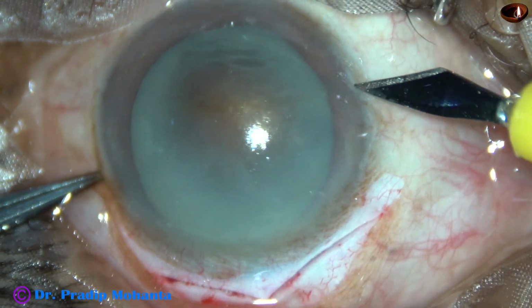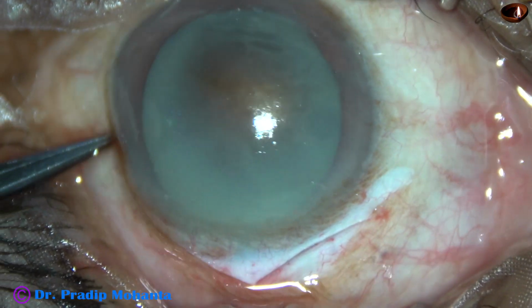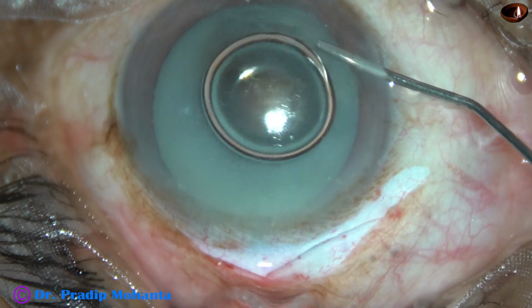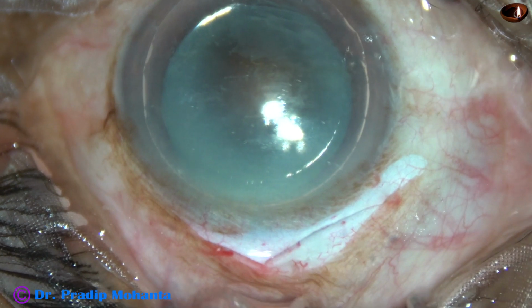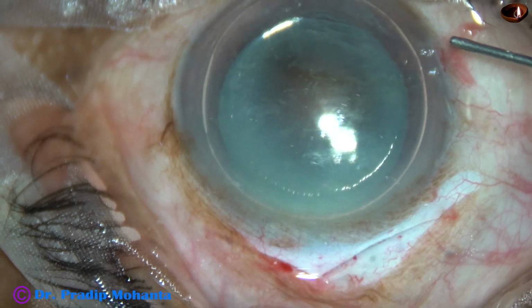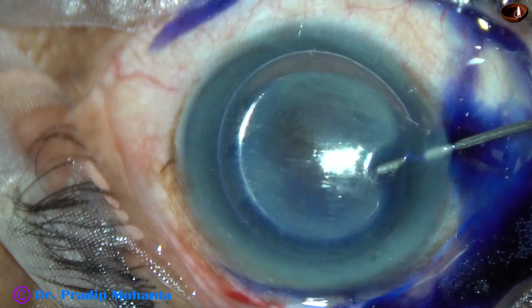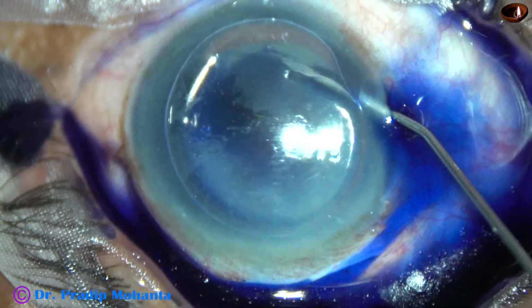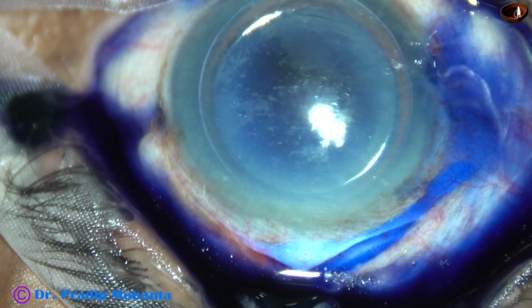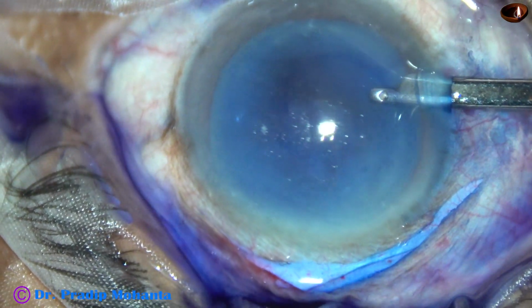This is a side port at around 8:30 or 8:45 o'clock, and an air bubble is injected. You can see milky fluid and a hard brown nucleus. So this is a very tough case for phaco. There is no epinuclear cushion, the nucleus is large and free floating. It is possible to do phaco, but a very safe technique is this: double SICS or LICS.